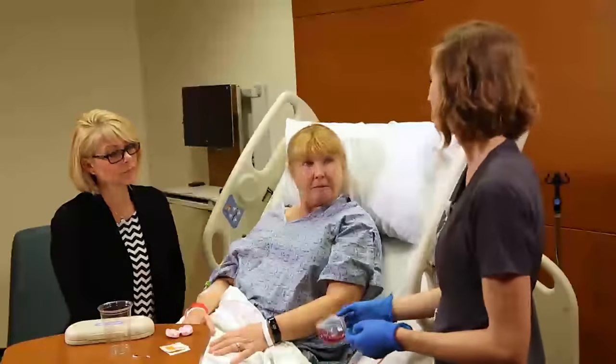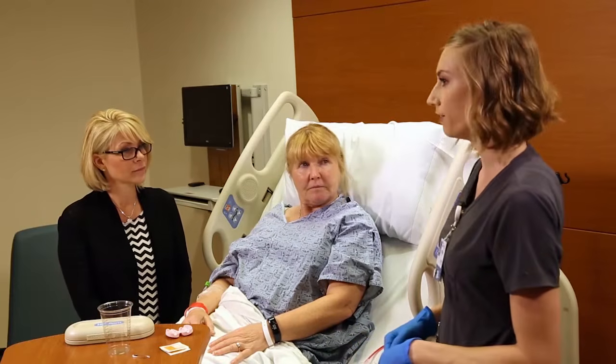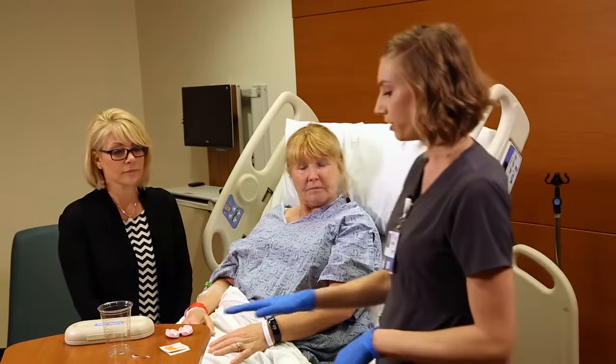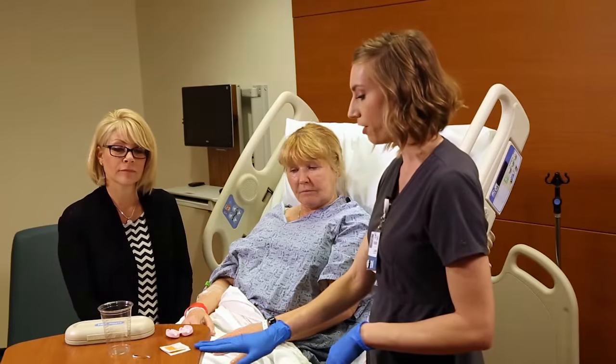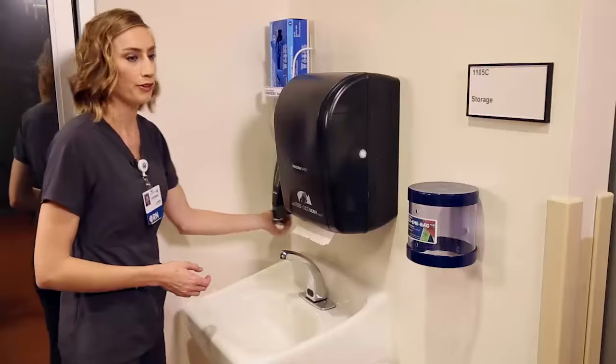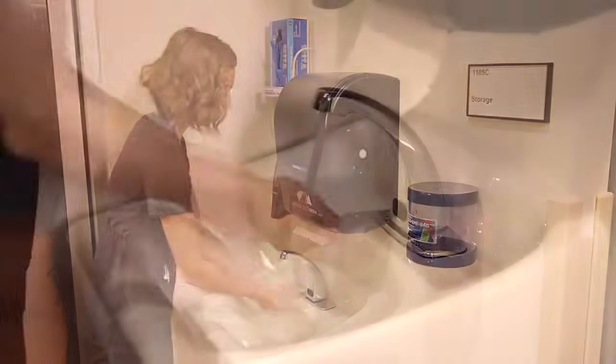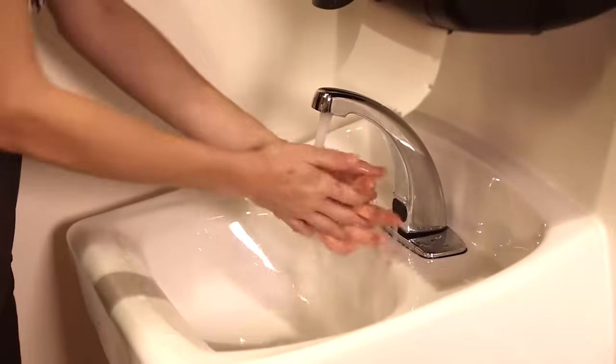That's great, Mrs. Smith. Before we begin, you're going to want to get into a comfortable position and have all of your supplies on hand. You'll need a Tubi drain stripper, an alcohol pad, and a measuring device. It's not necessary for you or your caregiver to wear gloves when you're at home caring for your drain, but you do need to wash your hands thoroughly before and after handling the drain.